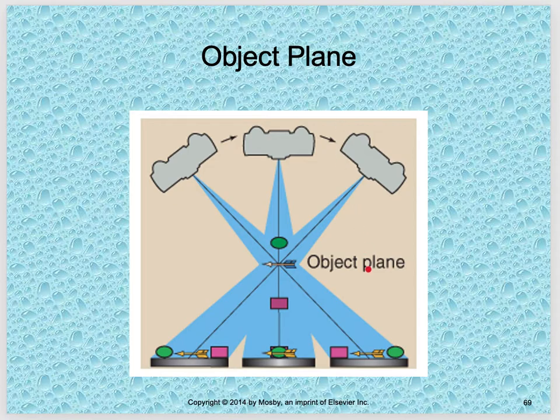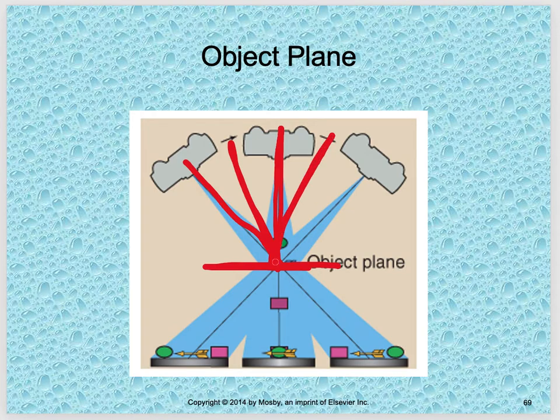So this is the object plane right here, and then your fulcrum, when it travels from here to here to here, it's still imaging that same object plane and creating an image here as it moves to here, and then as it moves to here. And that's why that image looks a little blurred, but it's creating that entire image in that object plane on that fulcrum.